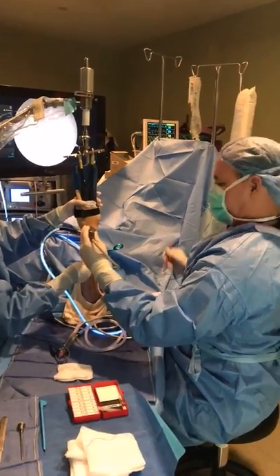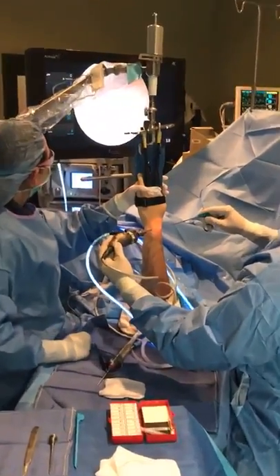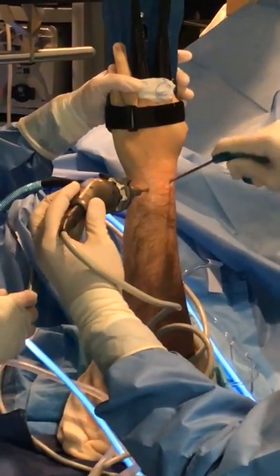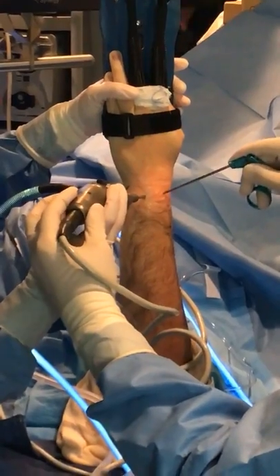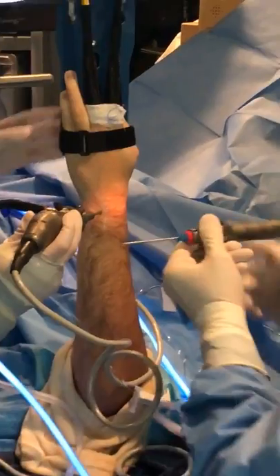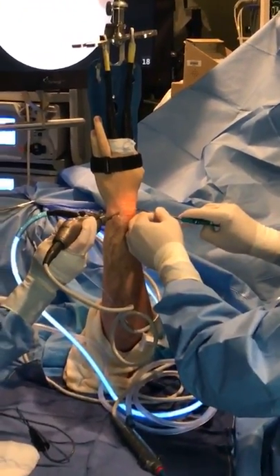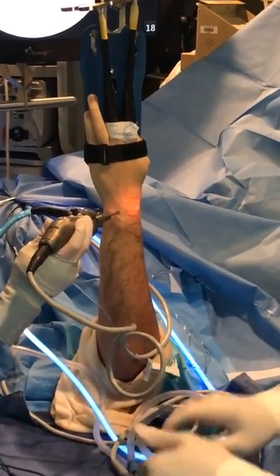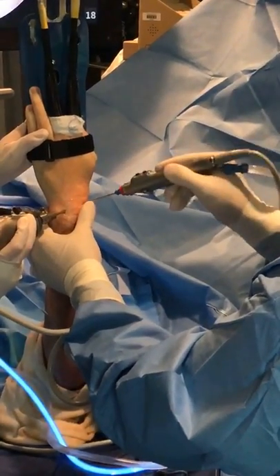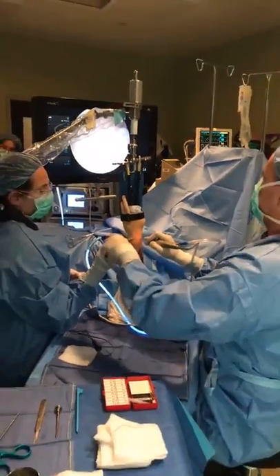I got a good picture here. Kate wants me to get the hair. Well, you still got a lot of synovitis. Let me have a shaver. Clean this up a little more first. What a handful. See, that's a lot of synovitis. Well, we haven't cleaned that up yet because we didn't have this perspective before. So before, our camera was where our shaver is.